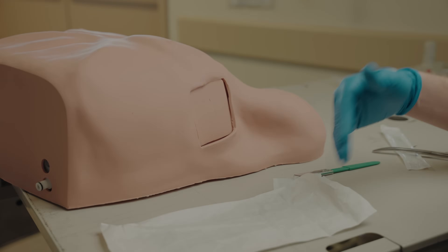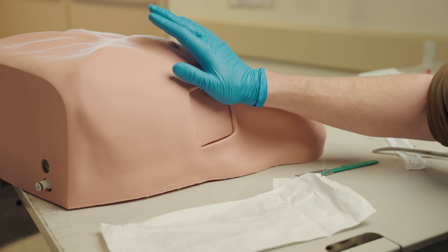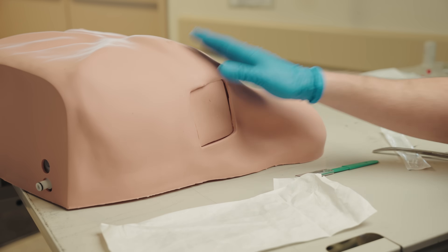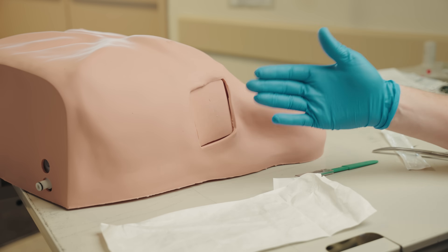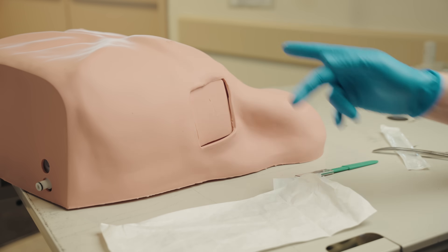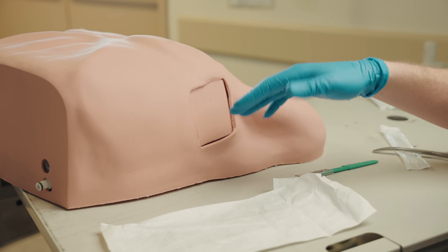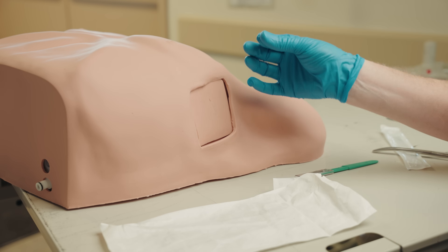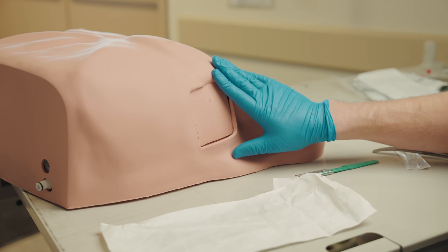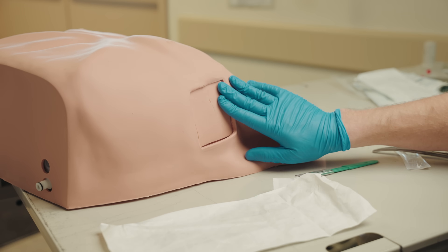One potential risk with this procedure — not necessarily to the patient, but to you — is that if they have a tension pneumothorax, chances are they also have rib fractures. Hypothetically, there's a risk of inserting your finger into their chest and, as you're doing your sweep, cutting your finger on a sharp, jagged edge of bone. You're in a very bloody environment, so that's going to be a very bad exposure for the provider and potentially for the patient. Just be aware of that and be cautious.